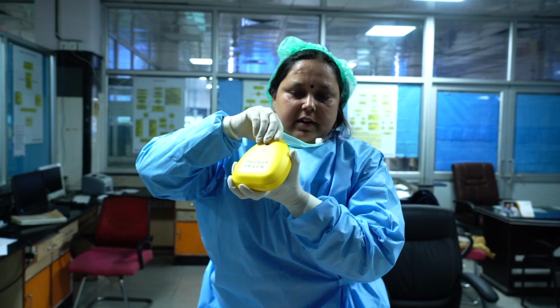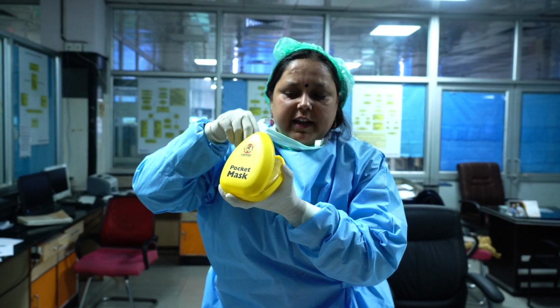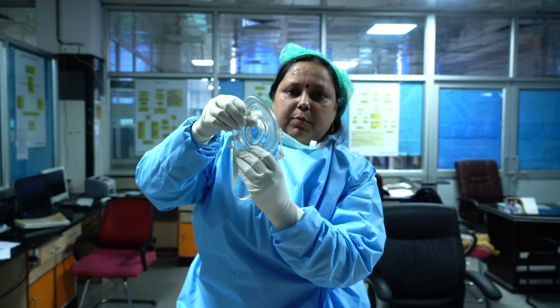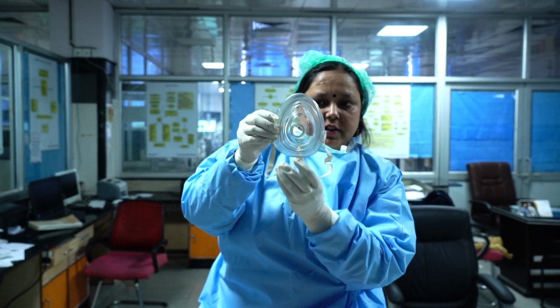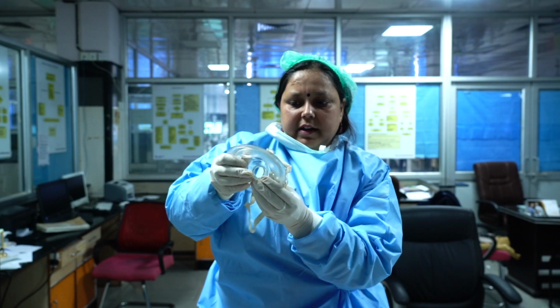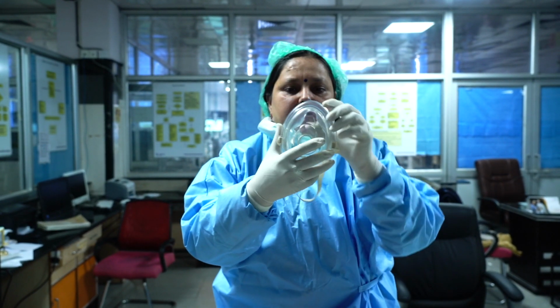Open it, lid open. We say this is a pocket mask because we can carry it in the purse or with us in a pocket. So we call it a pocket mask. This pocket mask is kept in a box in an already folded situation. So we will take it out from the box and then reposition it. Please reposition. After repositioning, this is the pocket mask.